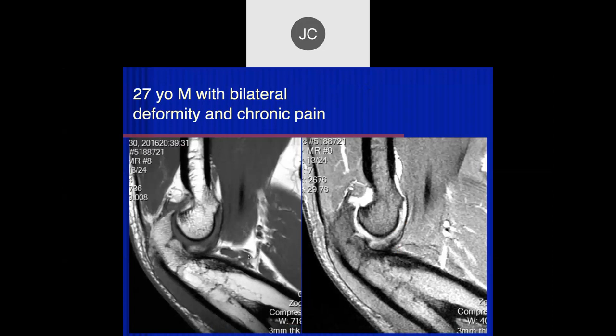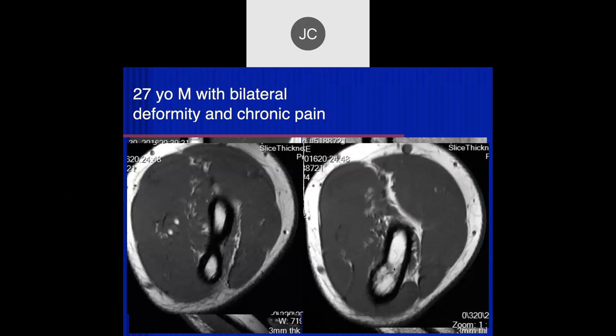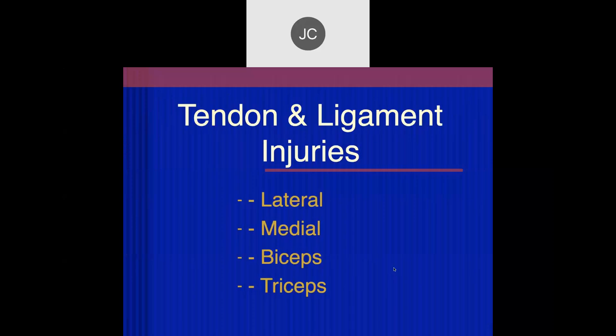This is a 27-year-old with bilateral deformity and chronic pain. It looks like there's a chronic-appearing deformity of that elbow joint - fusion of the radius and ulna. On the axial images we can confirm this is a congenital radial-ulnar fusion. Let's move on to tendons and ligaments - we'll start with the lateral, then go to the medial, then talk about the biceps and triceps.